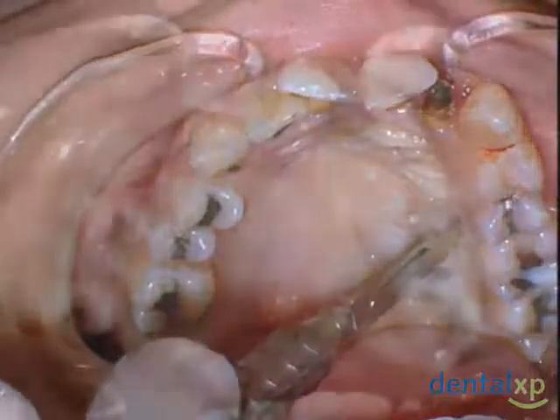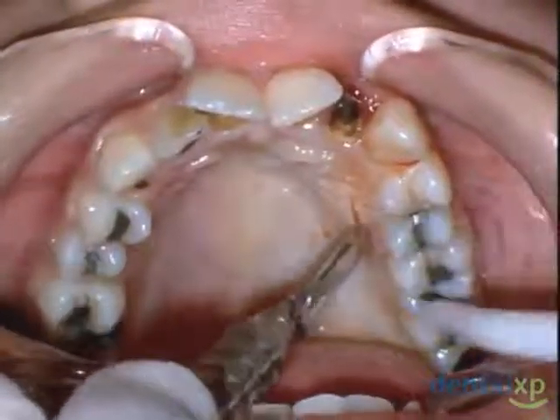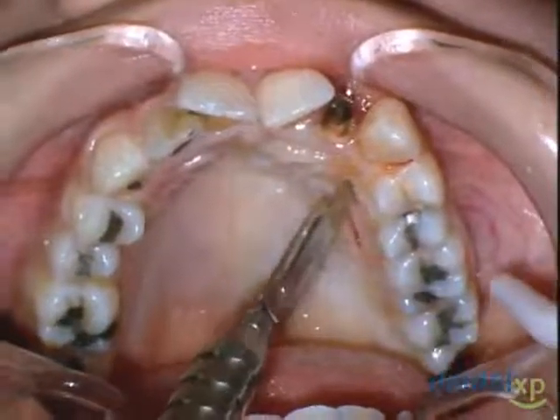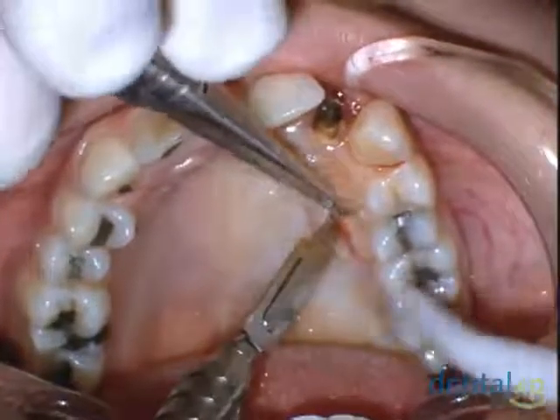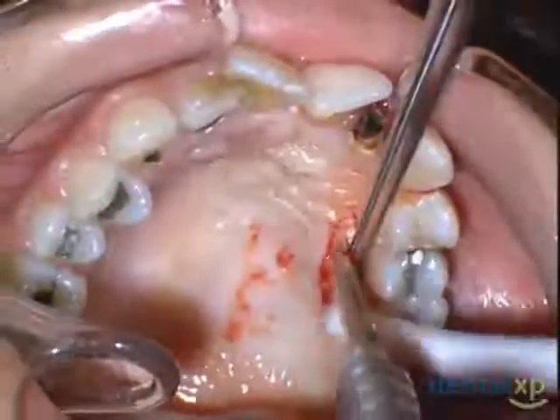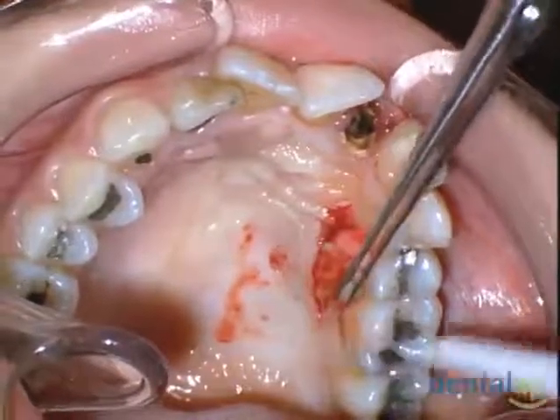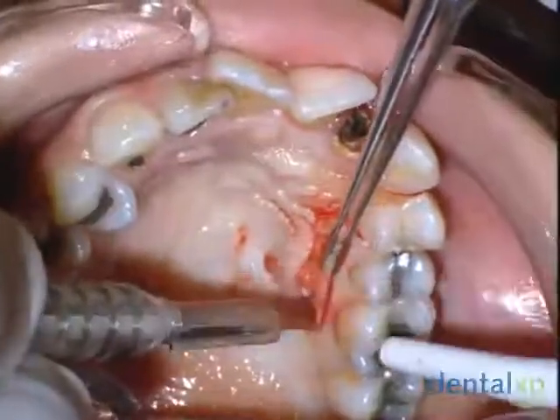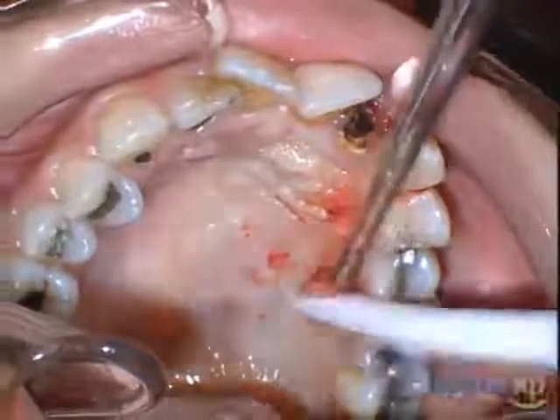What we usually like to do is use parallel incisions from the distal of the first molar to the distal of the maxillary left canine. These parallel incisions are then made elliptically and joined at the mesial and distal aspects. We then could utilize, as you can see here, small microsurgical tissue forceps to help extract the connective tissue from this palatal region. And this is a fairly common procedure in periodontal, aesthetic, and implant related augmentation procedures today.